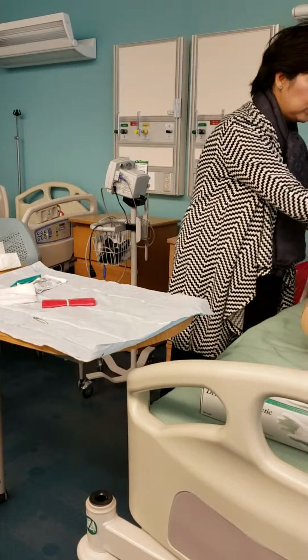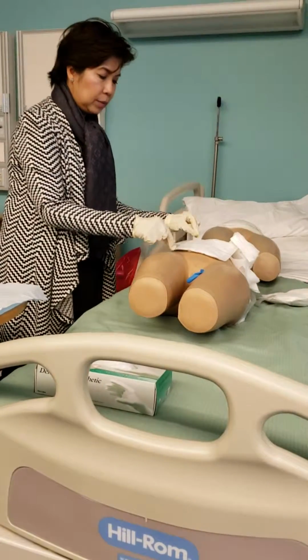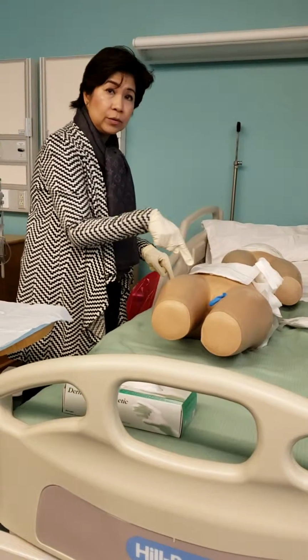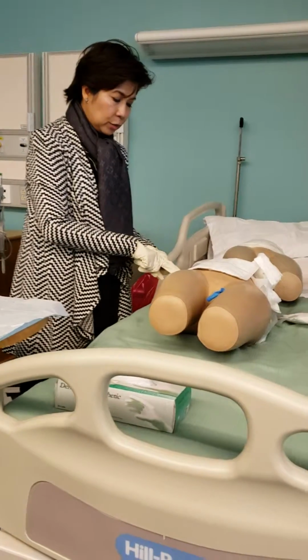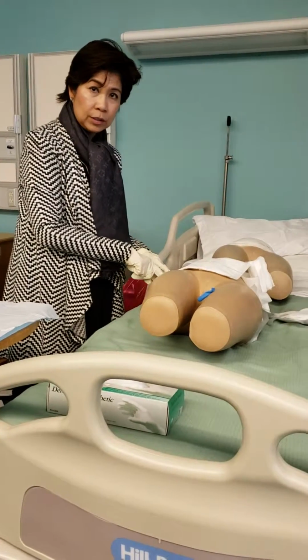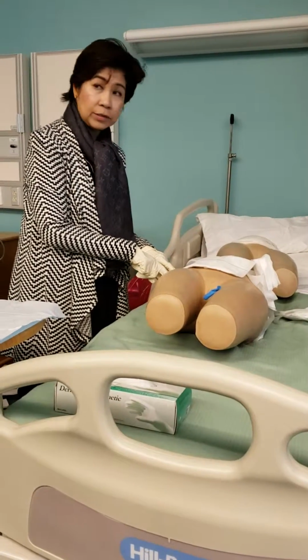And you have to tape all around. You can tape here, you can tape there. Once you tape all around, you can tape across or whatever. But you have to put your initials here again and put the date when you did the dressing.